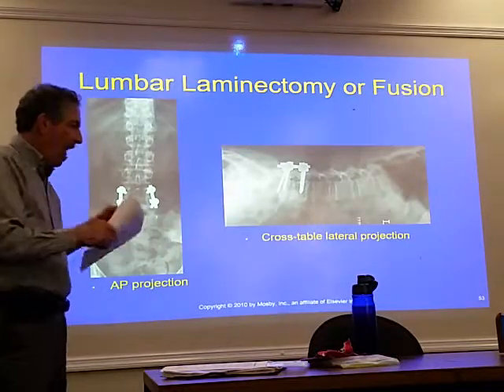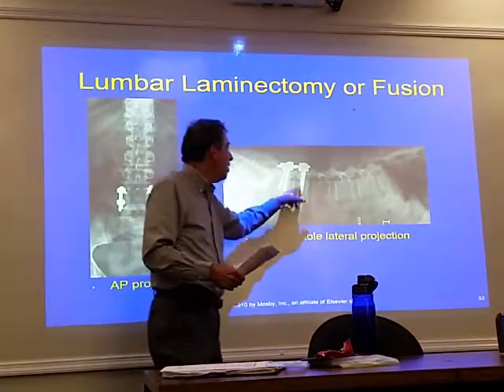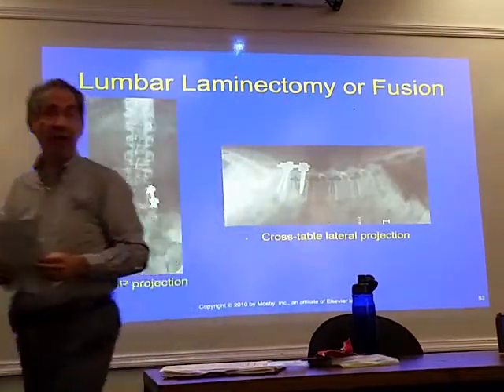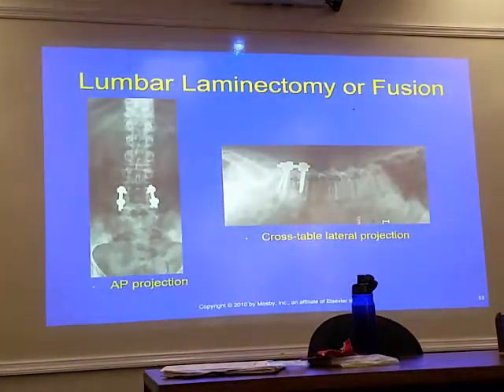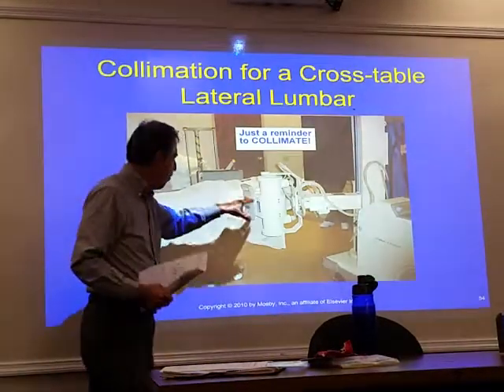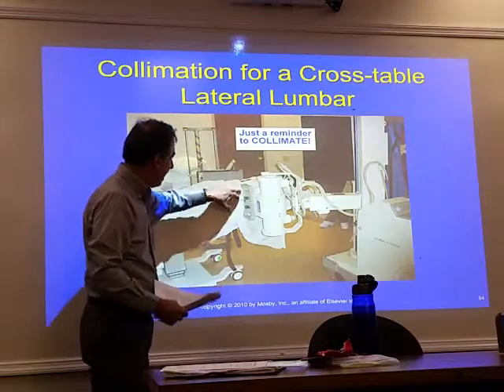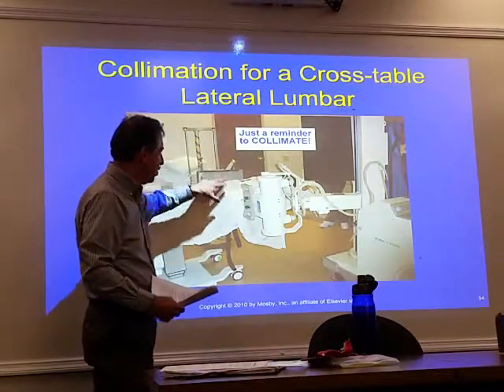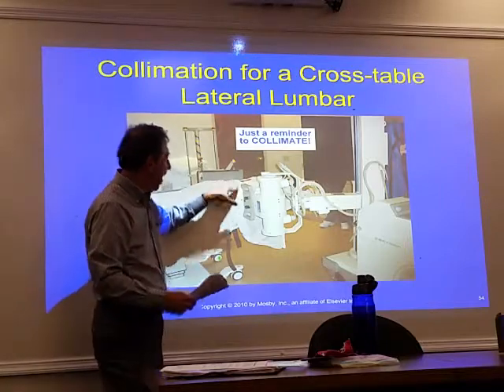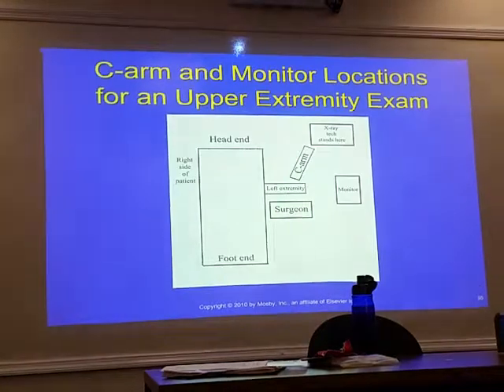Then they'll have you pull out, you go ahead and do a little bit more surgery, then they'll bring you back in to make sure that they're in the right area, okay? That's oftentimes all we really need to do with that. If you have to bring in a portable, collimate, don't keep that light open. A lot of times it hasn't had a chance to diverge, so you don't need a huge light field. So like I said, just keep that in mind.